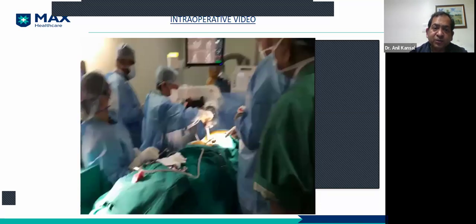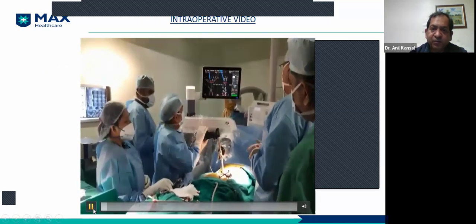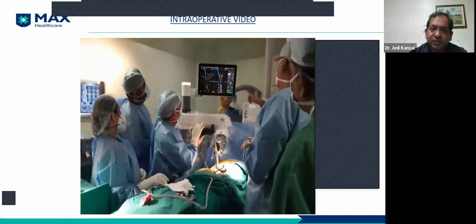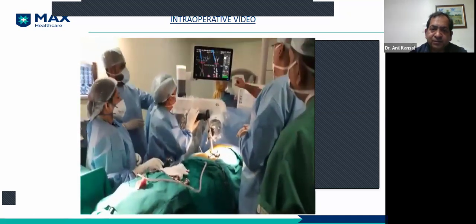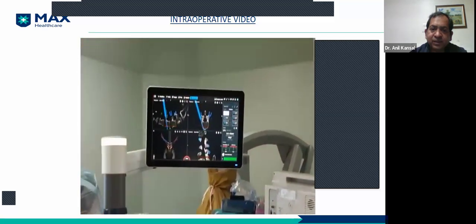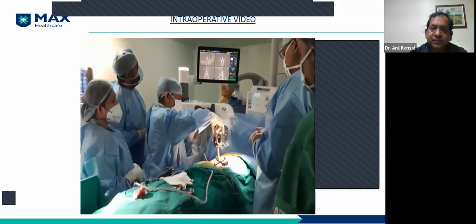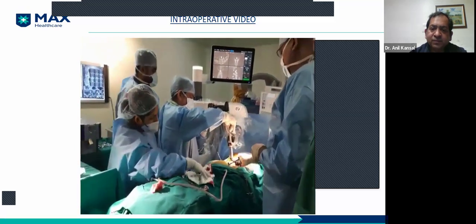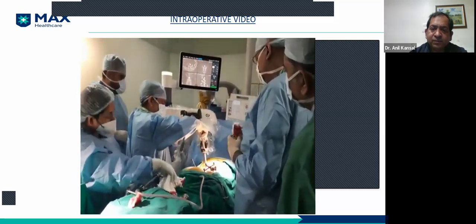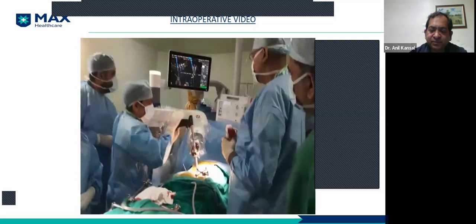This is how the screws are passed. So I'll show a video of this, how we put and we see the screws. So it's real time.